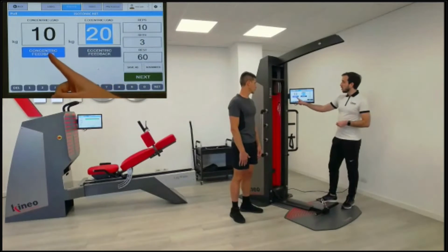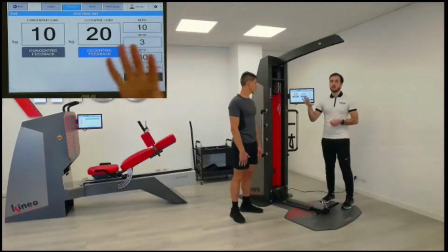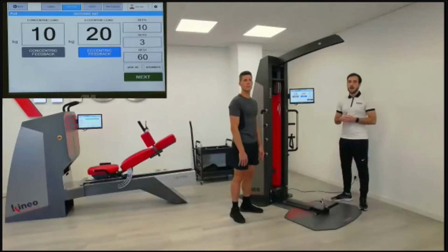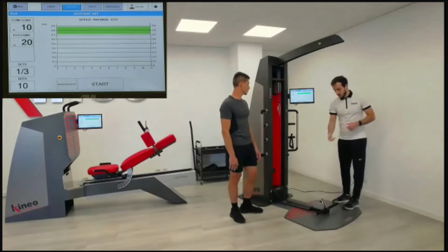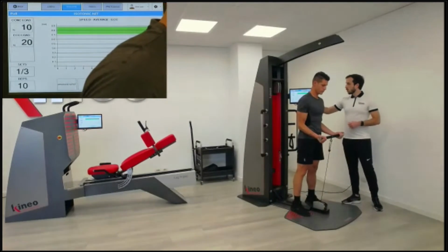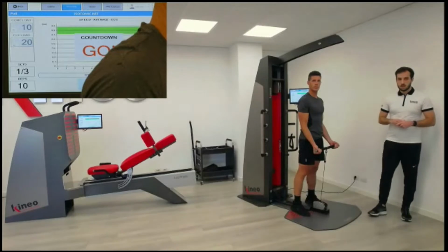As you see here, there is concentric feedback or eccentric feedback. Now, this basically will transfer on the display what is the execution of Damiano, and we will see how he is properly doing eccentric training. Okay, so we click next, and please, Damiano, come here, take the bar, and we will start. Of course, right now you can see the screen.